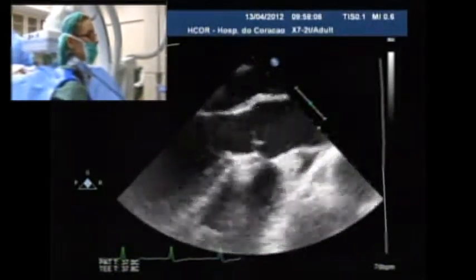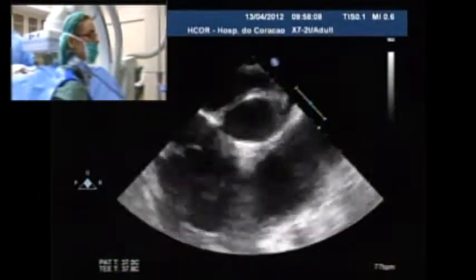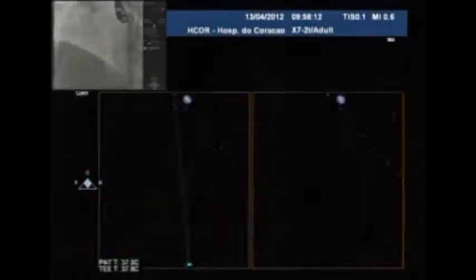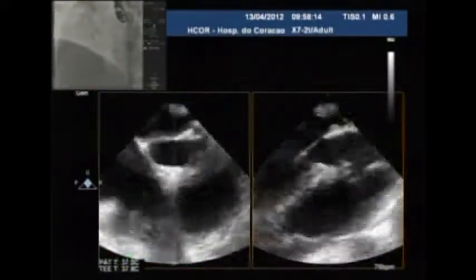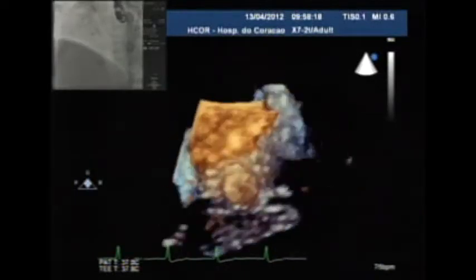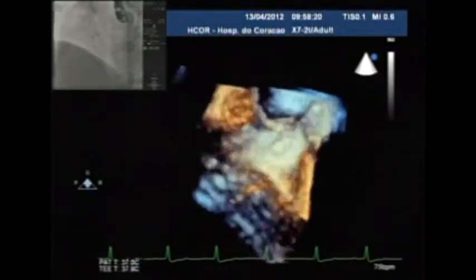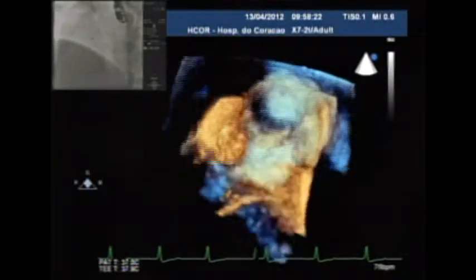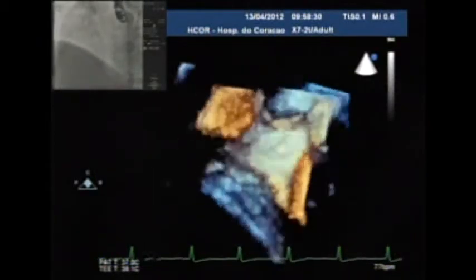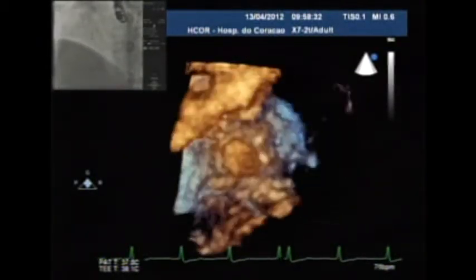Can you get some more 3D pictures? Sure, I'll do that right now. Any questions? These colleagues are also working on them. The audience. Working on what, Steve? Oh, there's a Chinese group actually that has a bioabsorbable VSD device as well. To the point that was made about fewer problems ultimately with tissue with an absorbable device, I think that is an exciting advent in this field.